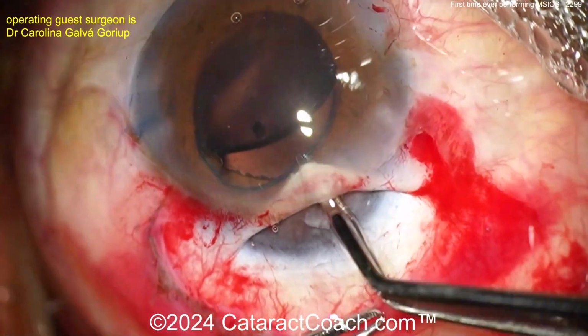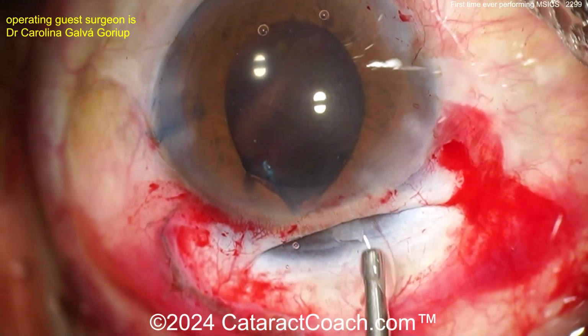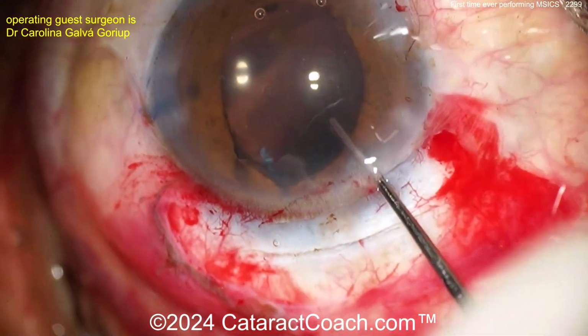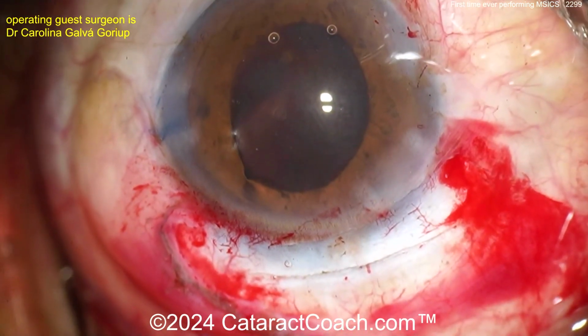So getting that there, hopefully in the bag. I think it's in the bag. There you go. Get that last haptic tapped in again. I usually just dial it around with a chopper or a Sinskey. There's the Sinskey. Now we're talking. Dial that thing around. You got it.